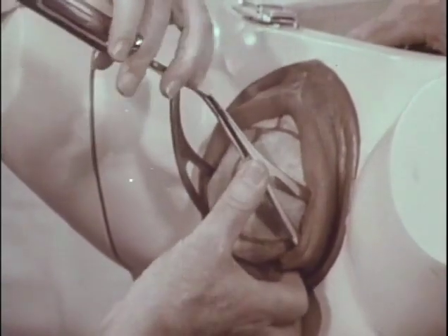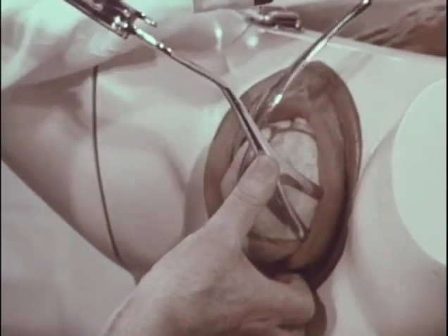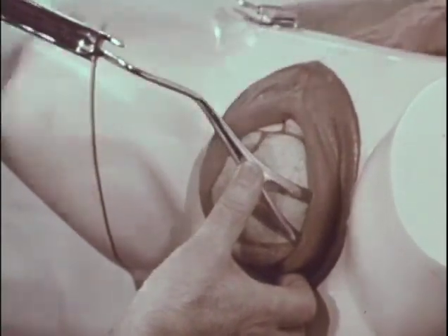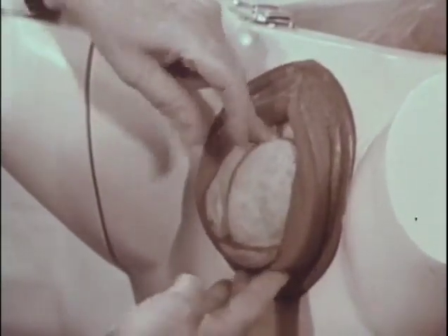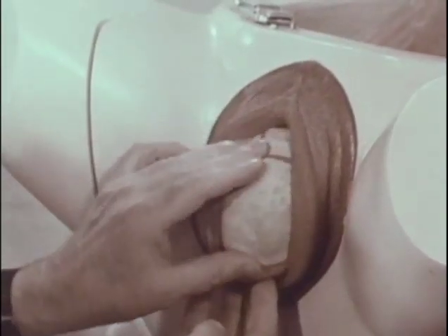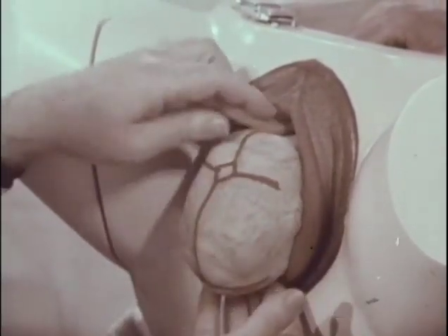Once it can be controlled with the modified Ritgen maneuver, blades may be removed. And then with fundal pressure, the occiput is expressed over the perineum, and then the head drops down with the forehead coming in under the symphysis as an occiput posterior.